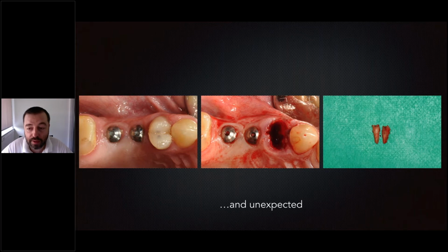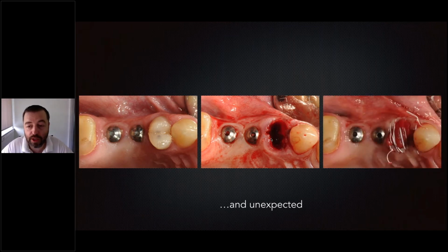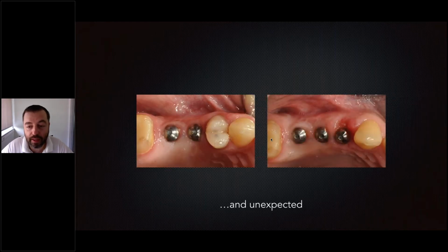You can cut the roots like this, from buccal to the palatal, such as when you have a monoradicular, not to put pressure on the buccal bone, especially when the buccal bone is very thin, and we want to immediately insert the implant, like it was for that case. So it was a combination between open healing and immediately implant placed here.